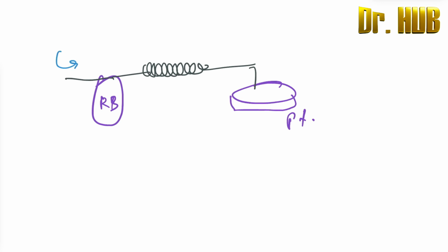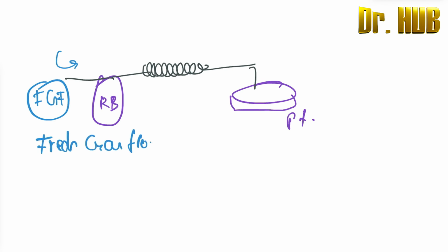First is where the flow happens. So this is going to be the fresh gas flow. So fresh gas flow is nothing but the FGF. Next, towards the patient side, there is going to be the APL. So what is APL? APL is the adjustable pressure relief valve.